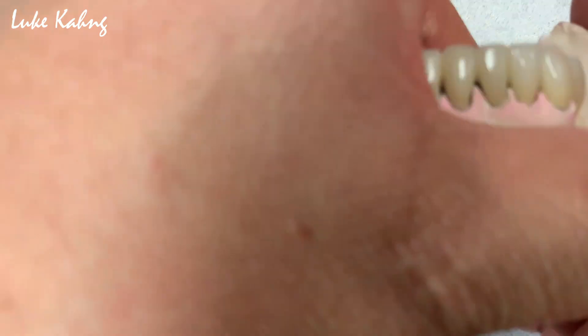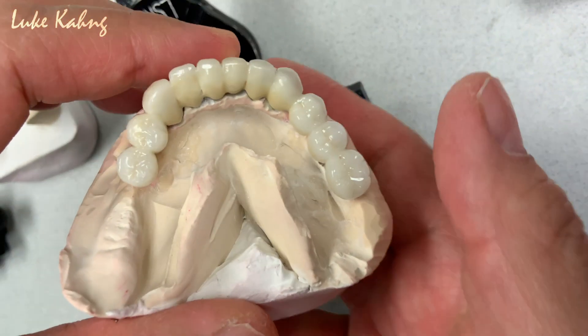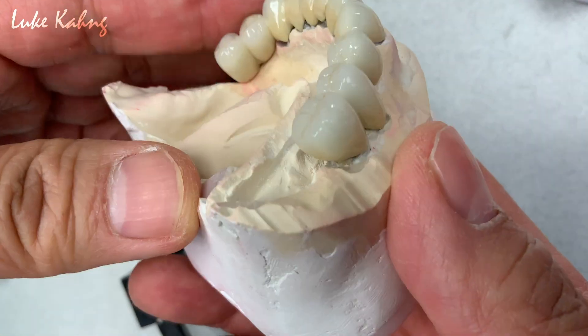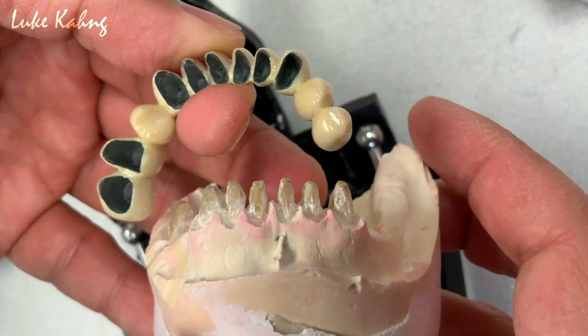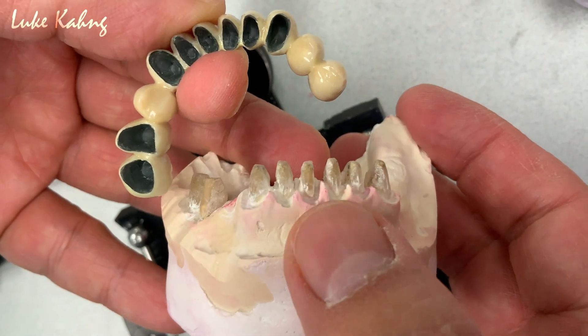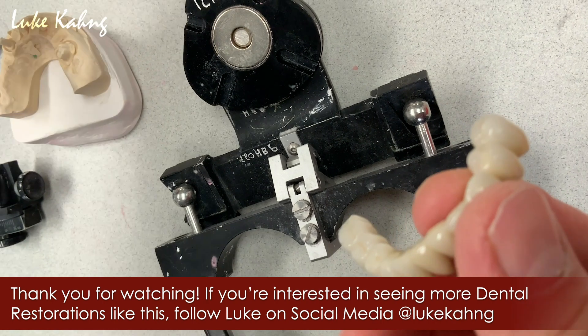Here is the lower. So we make a good cantilever pontic here. So we make a good cantilever — the doctor takes the pickup impression — so we have to be remounted. And we finish all this stuff. It's nice.